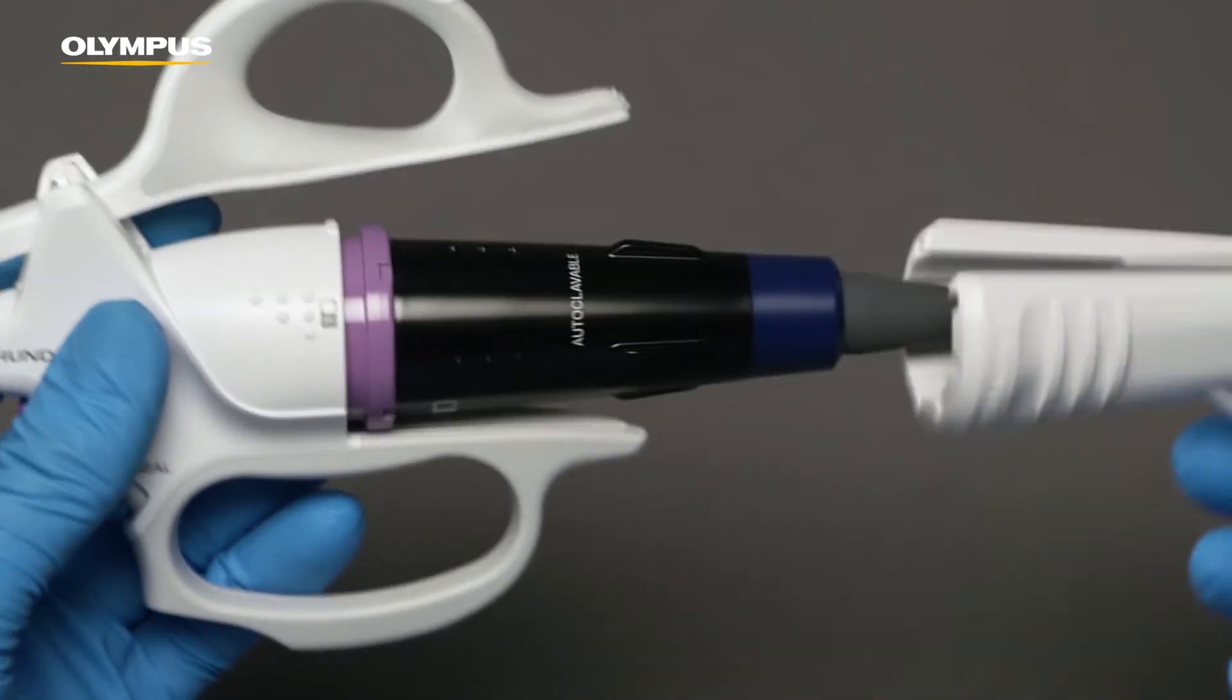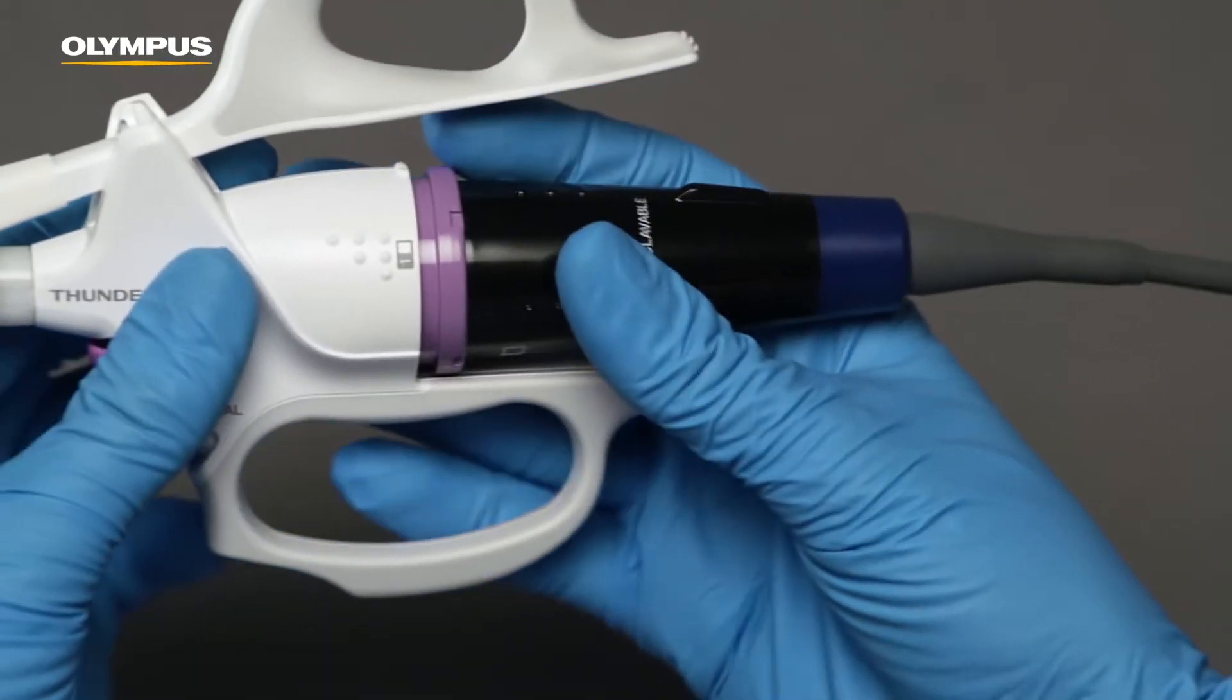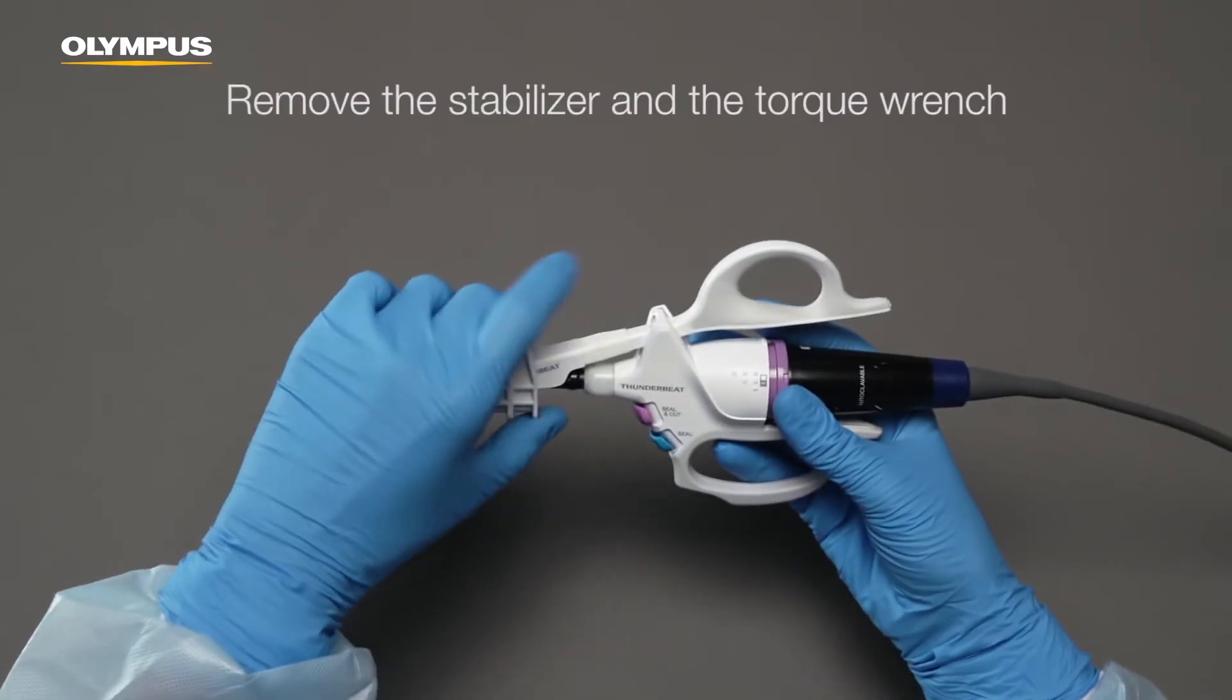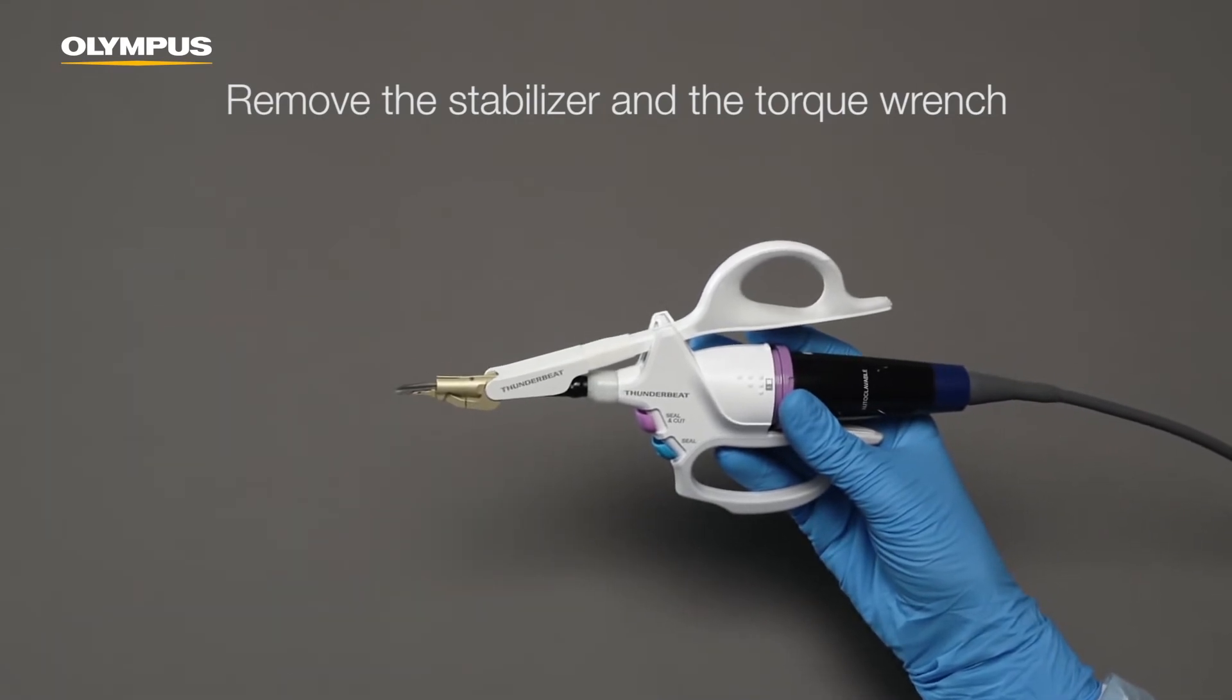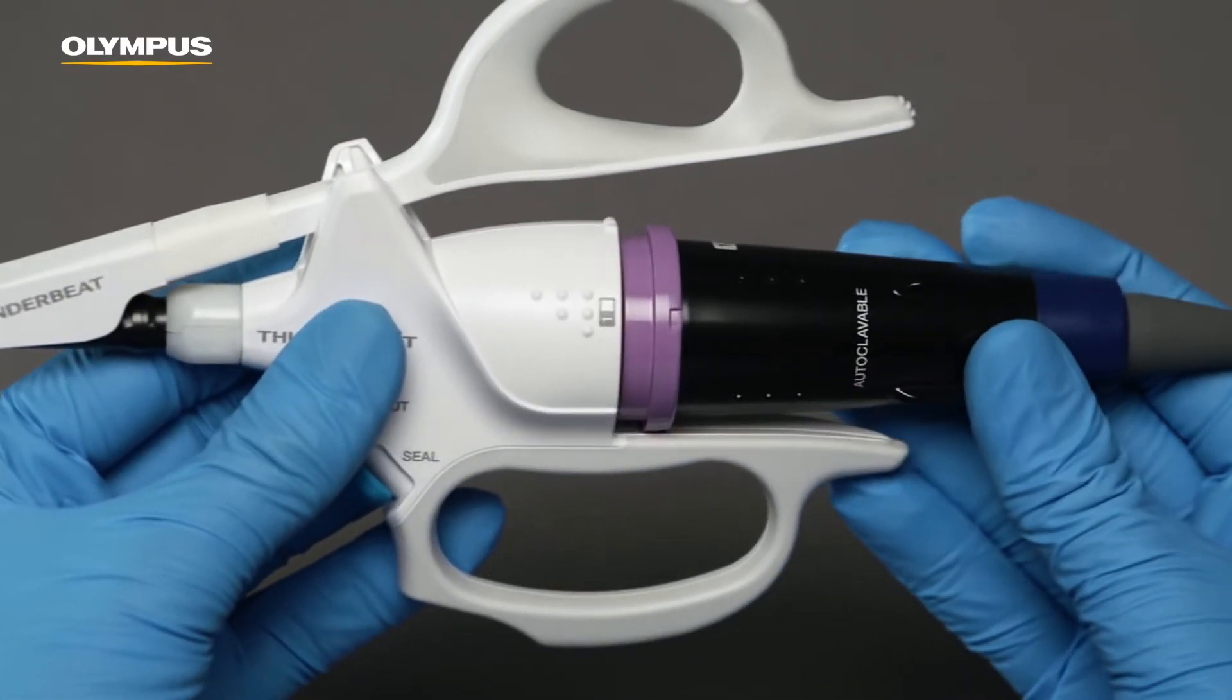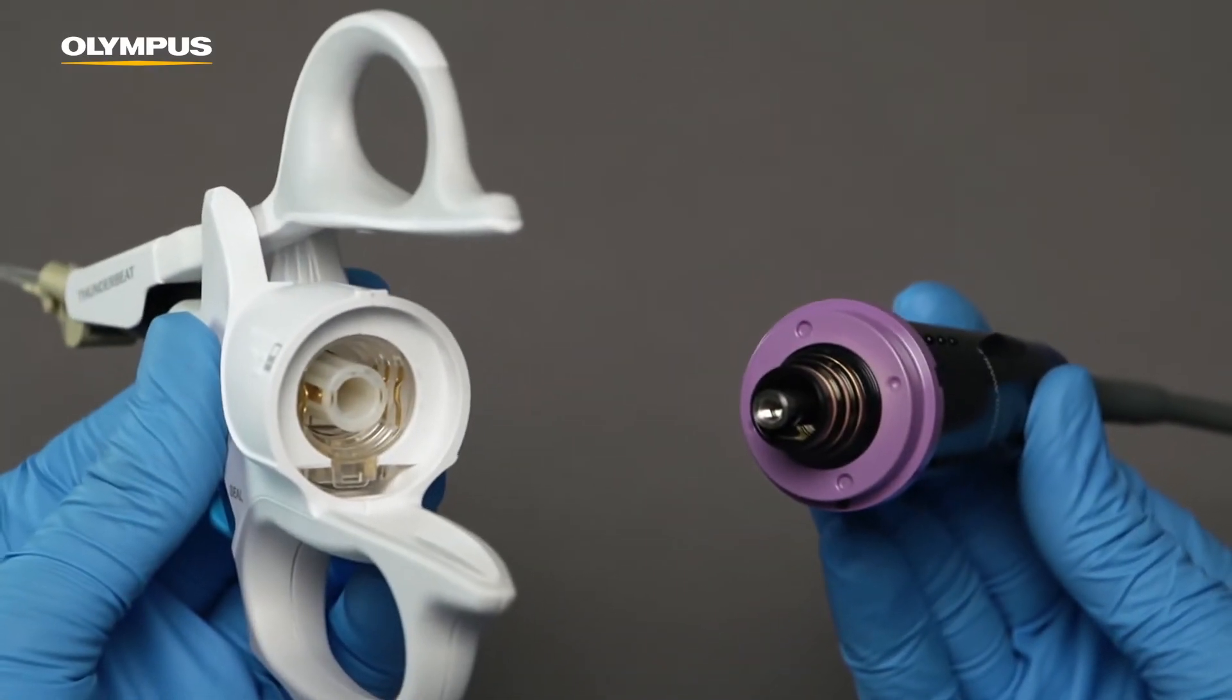Remove the stabilizer first and then the torque wrench. Hold the device at its base and disconnect the transducer.